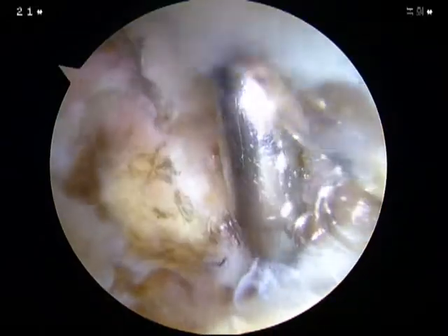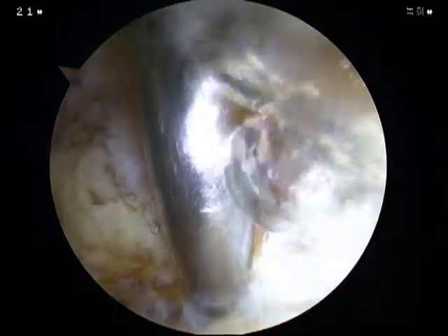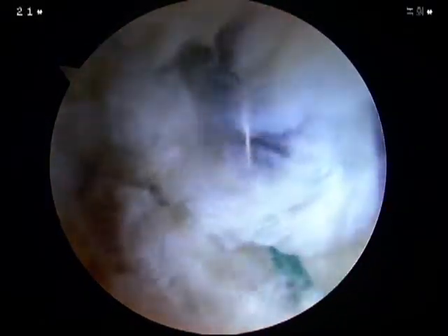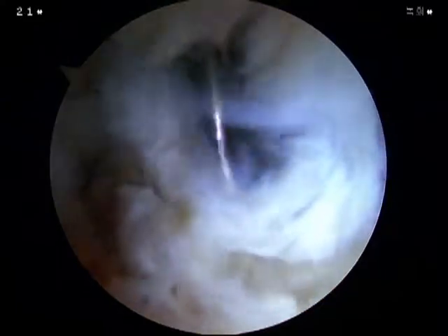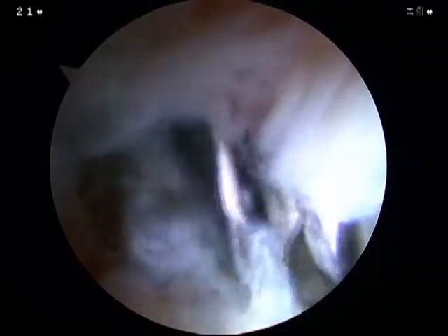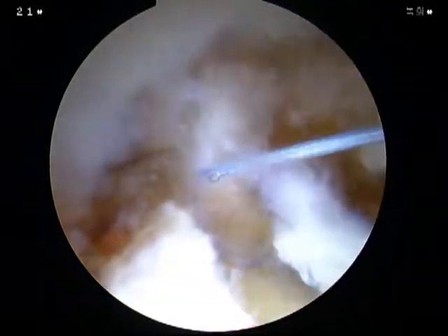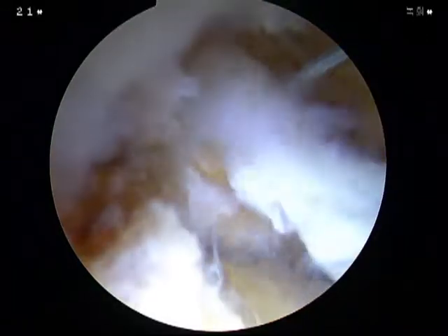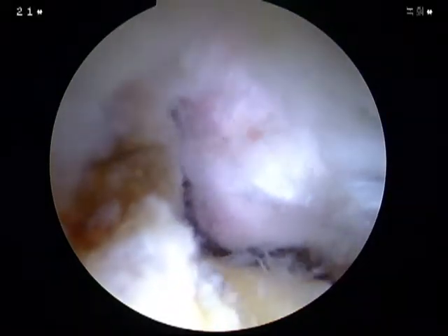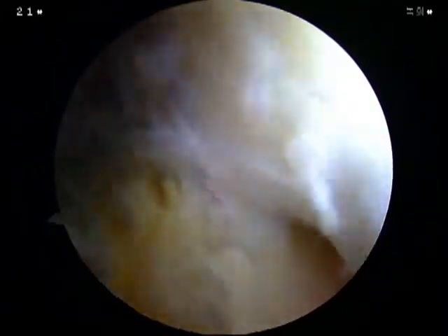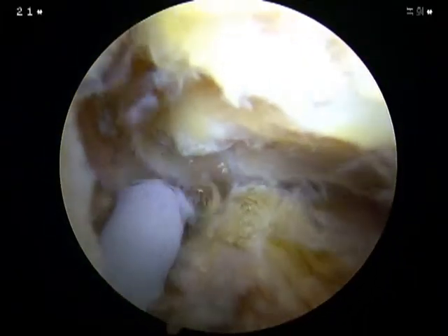To secure the site of the CAM lesion after capsulotomy, both wings are sutured through a hook and suture passer. After securing the site by locating both wings laterally, the adjacent tissues are cleared through a shaver and arthrocare.